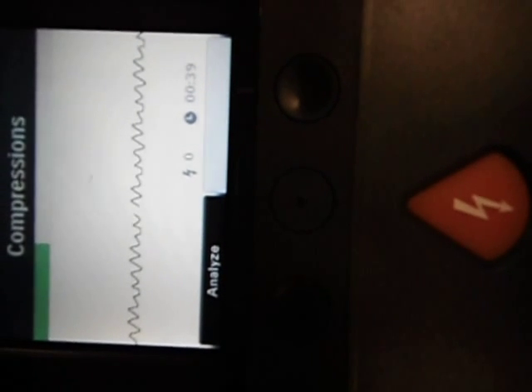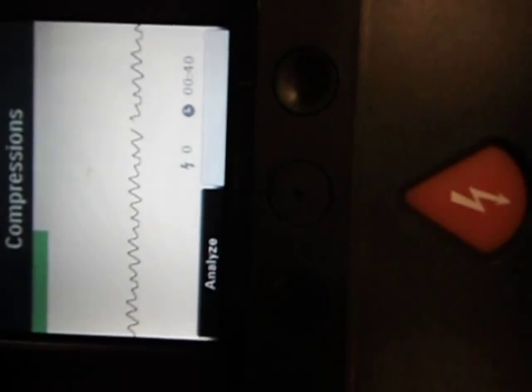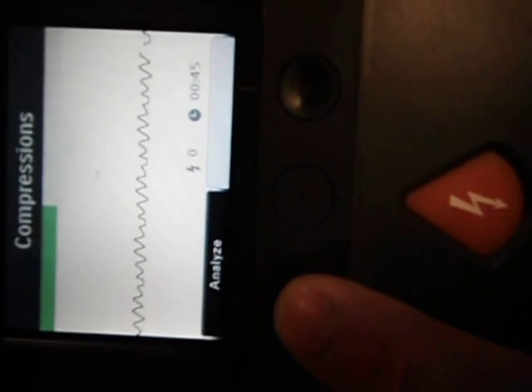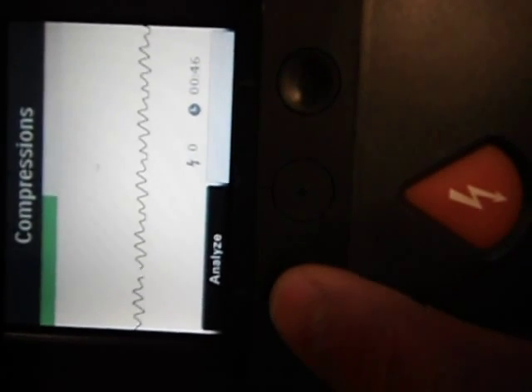If at any time we would like to analyze, we can interrupt, push the Analyze button, which we'll do now, to analyze.